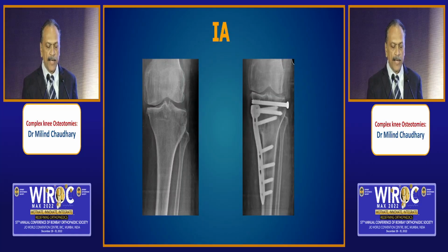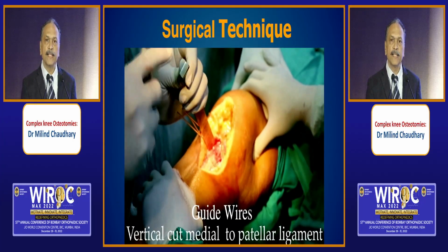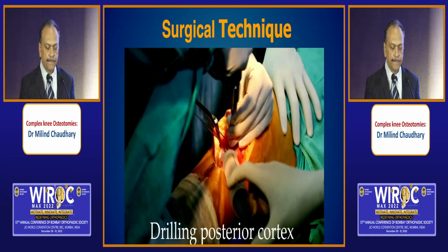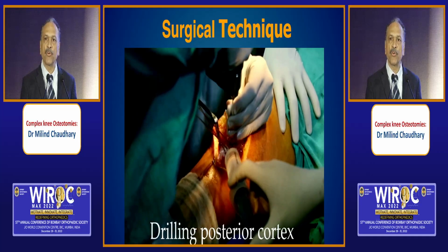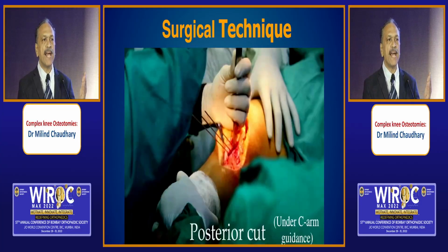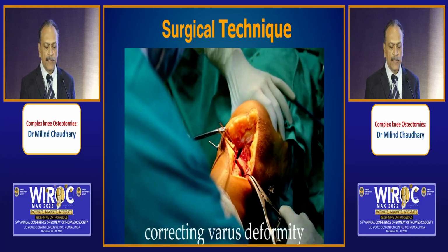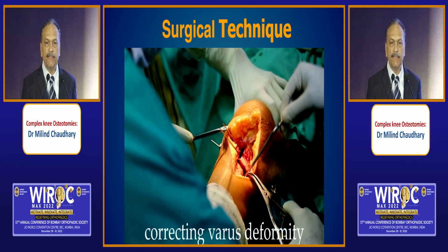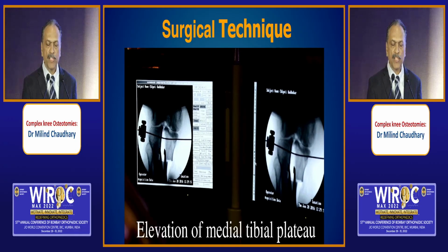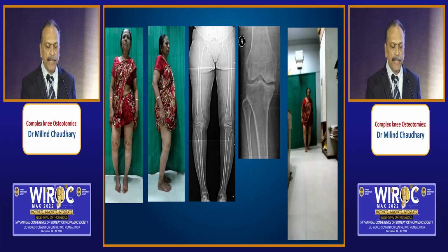So this is the intra-articular. This is how it looks when it heals. A very brief look at the surgical technique. Large incision, patellar retinacular releases. This is very careful drilling of the posterior cortex and cutting of the posterior cortex. And very careful entry into the intercondylar area. Obviously done gingerly and with great care. And then we elevate the medial condyle. Like so, we ensure it doesn't spread apart too much, till both the condyles make simultaneous contact. And then we plate it.